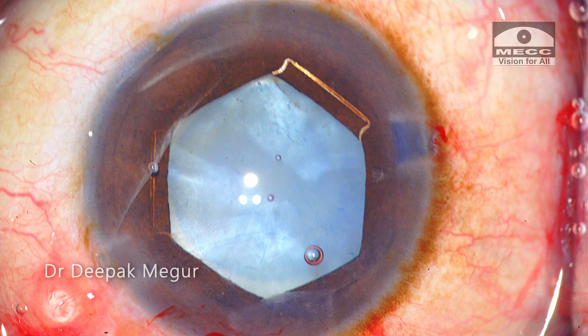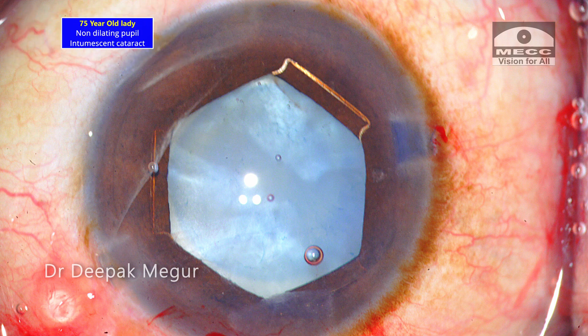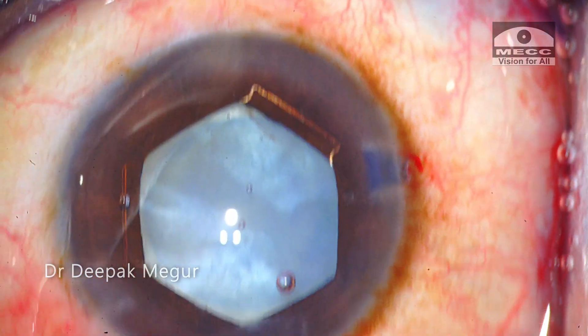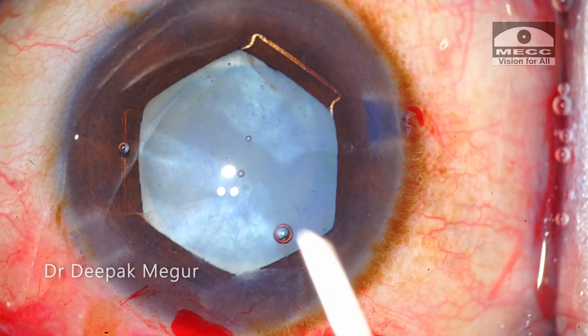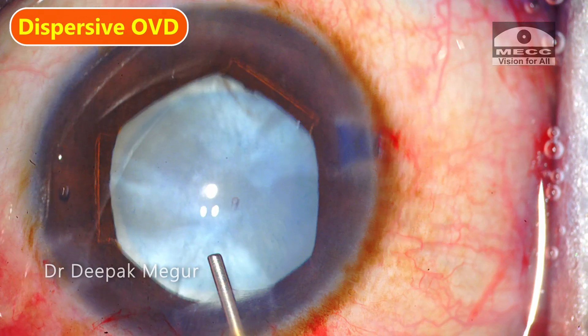Hello friends. This is a 75-year-old lady with a non-dilating pupil and an intumescent lens. Let's join the case in the middle. I have already placed the B-Hex pupil expansion device and I'm using dispersive OVD to maintain the chamber during rhexis creation.